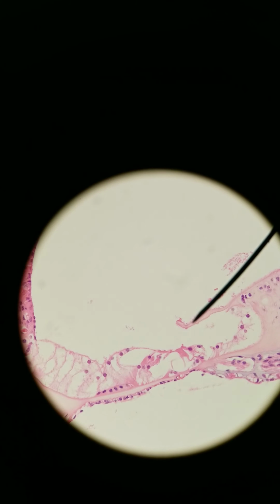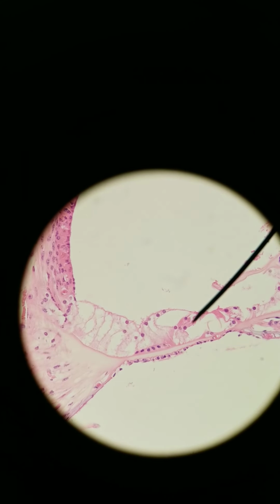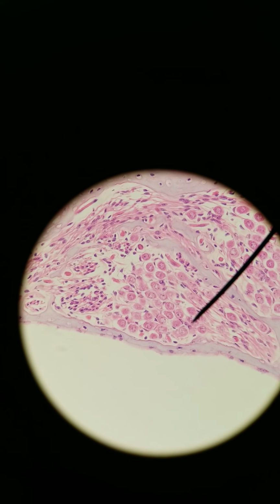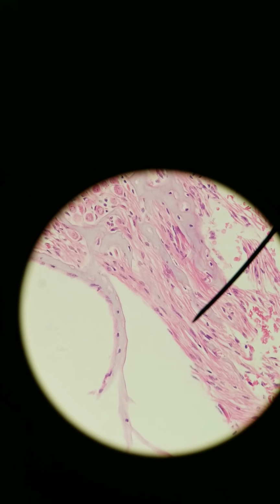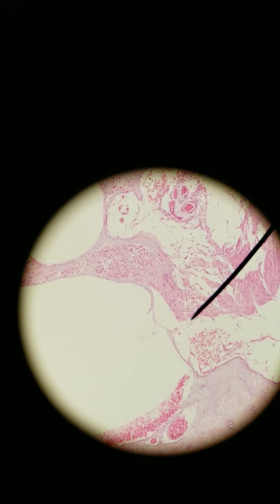So the tectorial membrane shifts, it moves the stereocilia of the hair cells. Hair cells down here get activated. Hair cells then communicate with sensory neurons. Here are the cell bodies of the sensory neurons, and the sensory neurons relay. Their axons form the cochlear branch of the vestibular cochlear nerve, going to the medulla, onto the thalamus, to the auditory cortex in the temporal lobe. That is what we can see here in this histology of the cochlea.